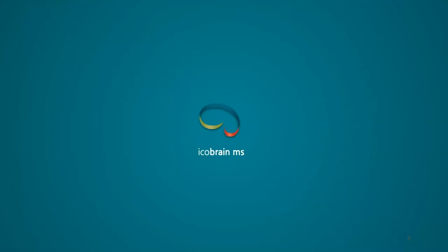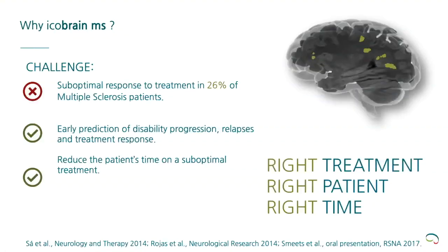So first, introducing to you icobrain MS, our cloud software for the processing of brain MRI scans applied for multiple sclerosis. In multiple sclerosis, we know from literature that almost 26% of the patients start on a treatment that gives a suboptimal treatment response.